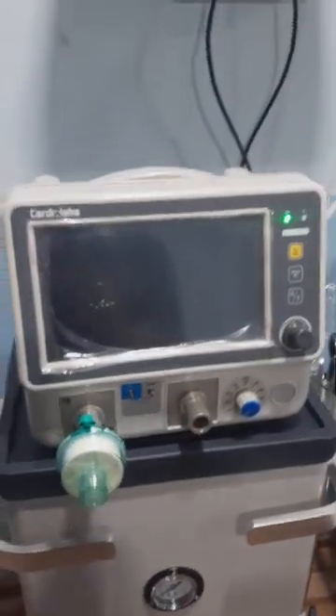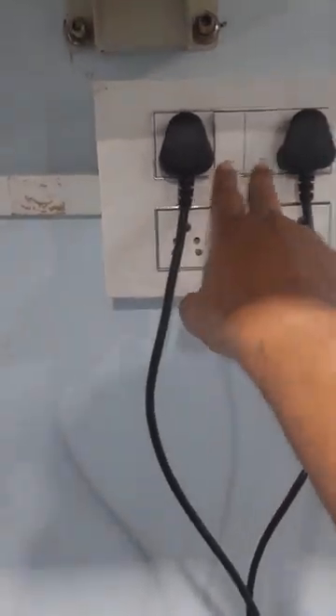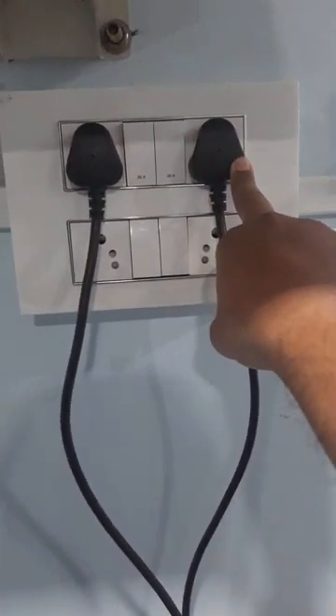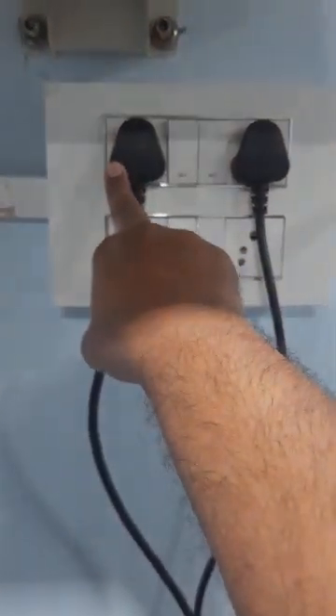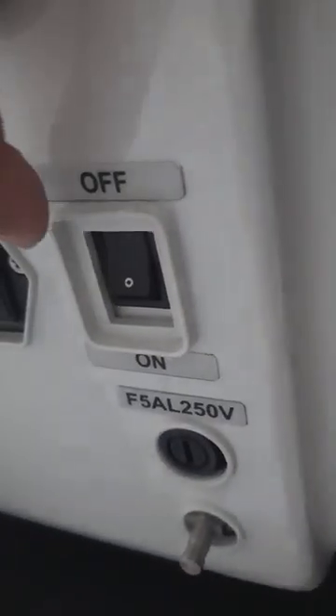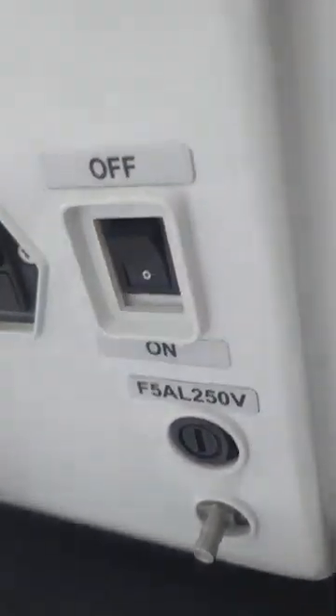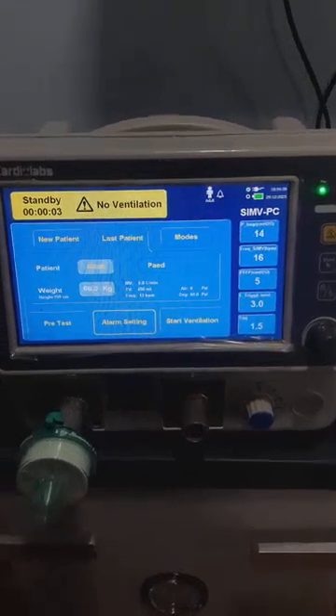To start the ventilator there are two connections: one for the display monitor and the other for the compressor. We have switched on both of them. After switching on the display, we get the reboot of the display.